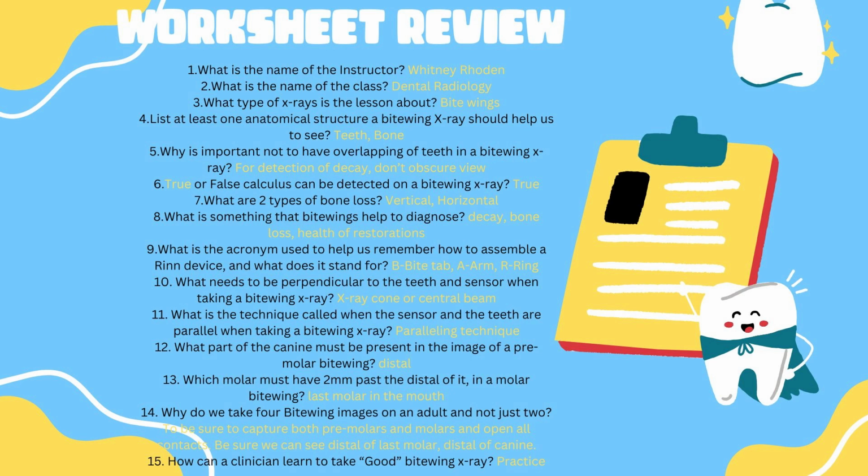And number 6, true or false, calculus can be detected on a bite wing x-ray. True. We talked about that several times, pointed out some images that showed calculus. Of course, you still need to go back through and clinically check, but it's nice to reference back to the bite wing when you're also checking in the mouth to see the calculus. We use x-rays often too after we've cleaned the tartar off. We'll take another x-ray and see if it's still there.